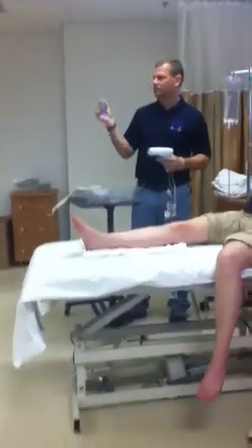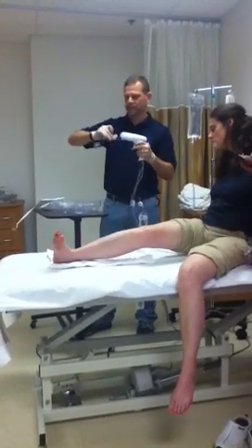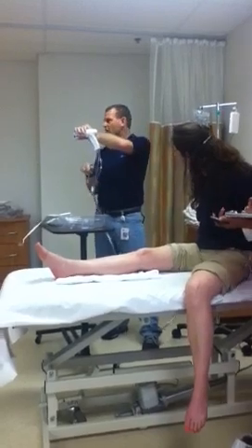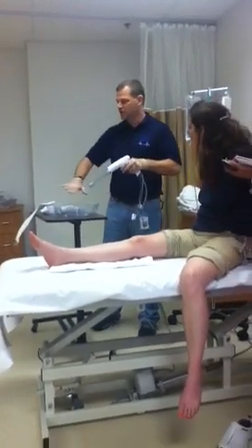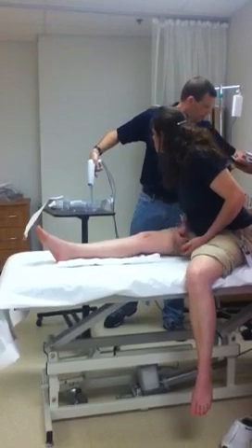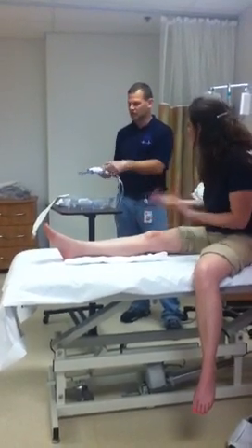I have my wand, and now I have my fork. That little blue thing in there is just helping it keep its shape, so I've got to get that little guy out of there. Then I've got to stick this in — I can only go in one way because water's coming out of here. There are two ports: one's suction and one's going to be the water. I can actually turn that on and make sure that water is being sucked up as it's being shot down. It is spraying and sucking simultaneously.